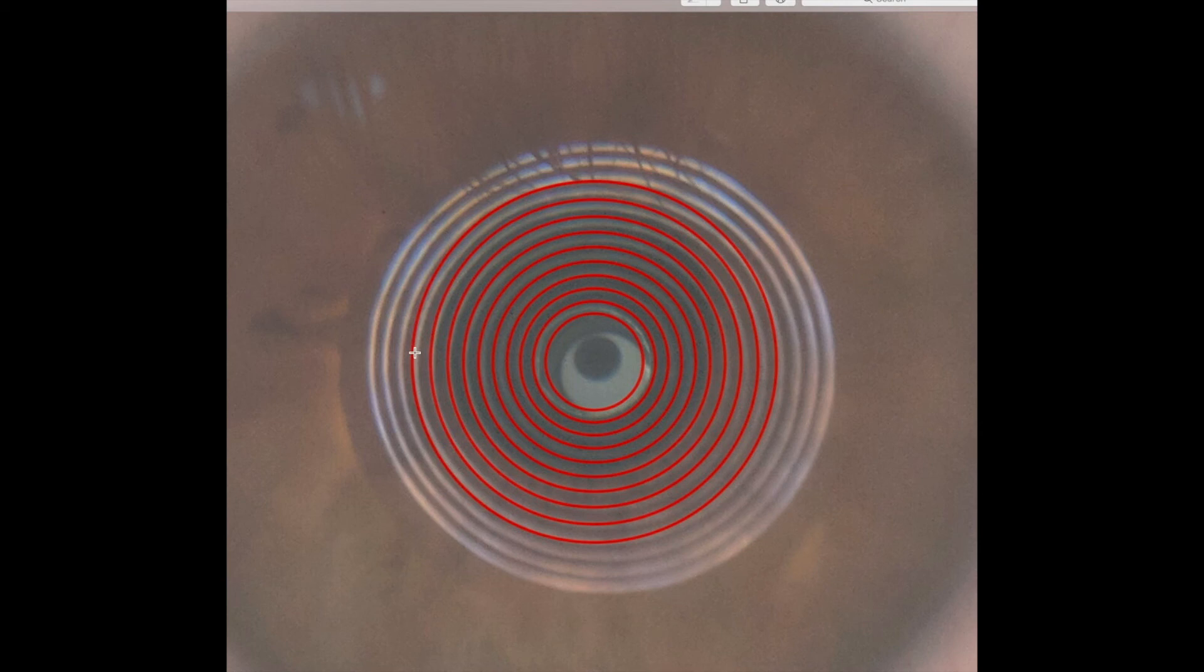So here's the same image, but with the ring superimposed. Now it's really obvious what's going on. The red rings are the reference rings, and they're round. And so what we're looking for is deviation from these rings. And you can see really clearly that horizontally, the white rings, which are the ones that are obtained from the patient's cornea, are pushed out.